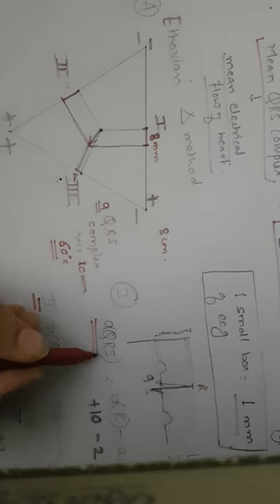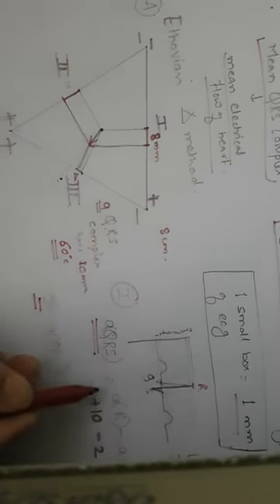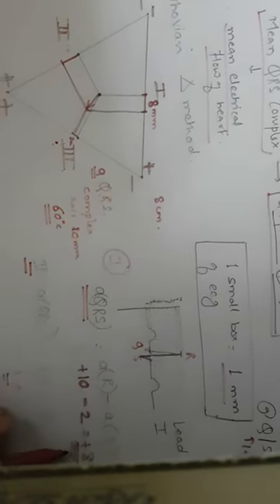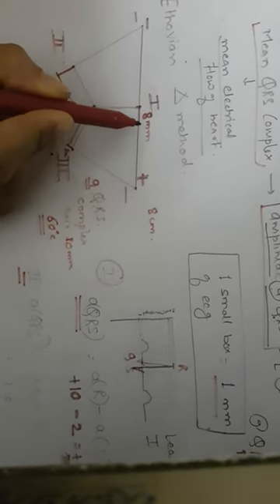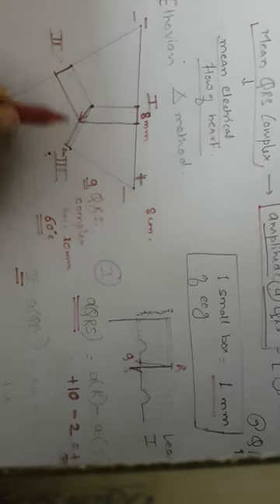Okay, so first step, you draw the equilateral triangle, then you find out the center of the equilateral triangle, then you find out the amplitude of QRS complex in lead 1, 2 and 3. How to find out the amplitude? Amplitude of R wave minus amplitude of S wave or Q wave, whichever is larger. So this is how you get your amplitude of QRS complex. Then you have to plot it on the leads like this, towards the positive side, towards the positive side, towards the positive side.